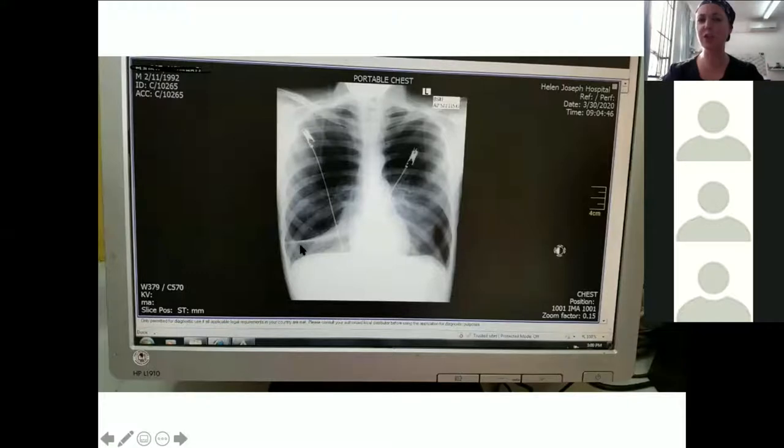So I wonder if this patient has had previous TB and has got all fibrotic changes down the bottom and then a pneumothorax probably from that TB. You've got some infiltrates on the right-hand side as well. And this x-ray, it's really not too clear what's going on because I'm worried about this line over here on the left-hand side. I'm worried that this patient's got a pneumothorax on the left as well, which would be really unlucky for this patient. I'd like to have a slightly better quality x-ray just to confirm what I think is going on the left because I'm not 100% sure there.